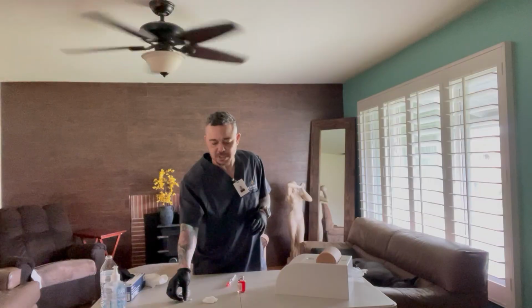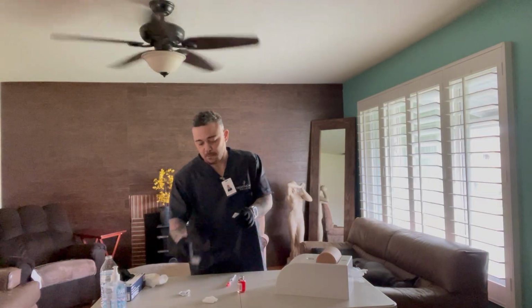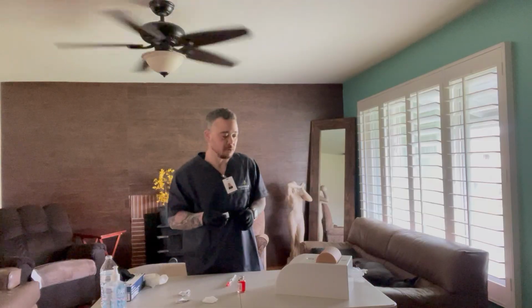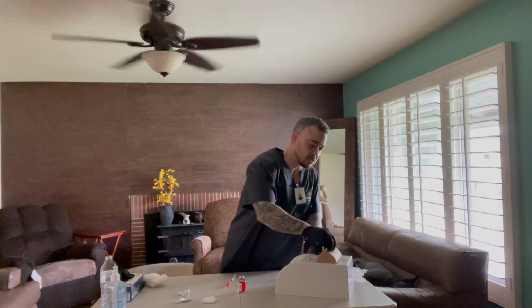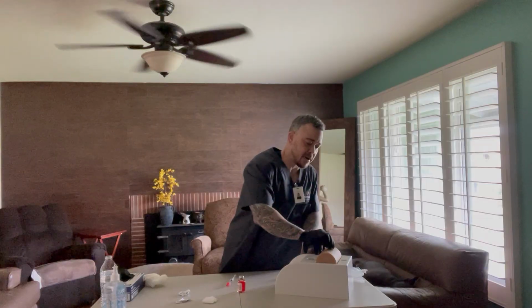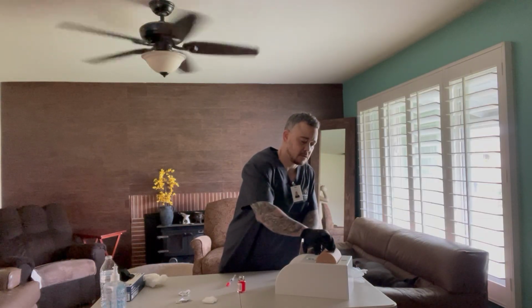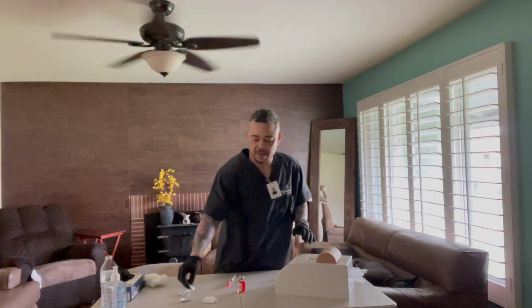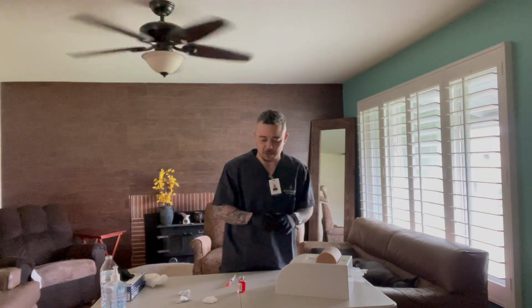The next thing I want to do is clean my site. Once again, I don't have another alcohol pad, so this is a used alcohol pad, but for the purpose of the video, I'm going to use it. If this was a clean one, I would clean my site in a circular motion, about 5 centimeters out. Okay. And while that's drying, I'm not going to wave it or blow on it or anything like that. Just allow this to dry.